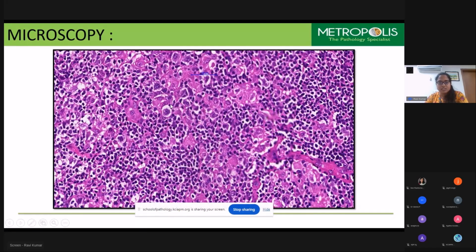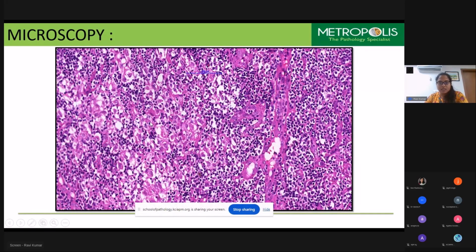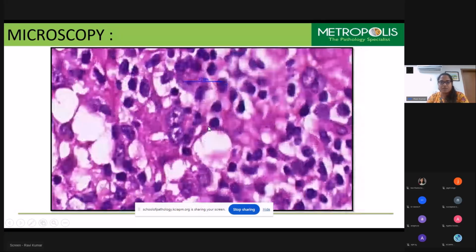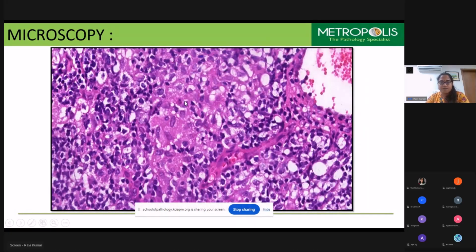This is a cell like Dr. Ajit already pointed out, a mummified kind of cell. This is another aggregate of histiocytic cells. And coming to this one, it's a mononuclear classic Reed-Sternberg cell, mononuclear type. Binuclear form. And there were few, occasional microgranulomas, epithelioid microgranulomas were also there.